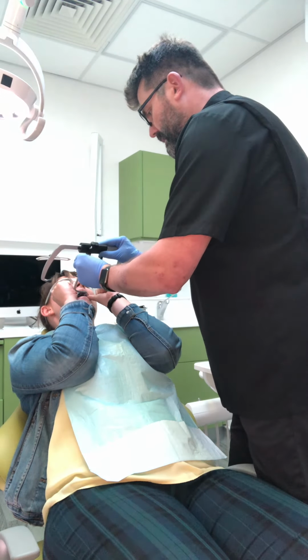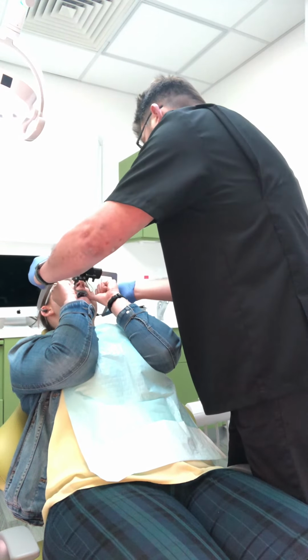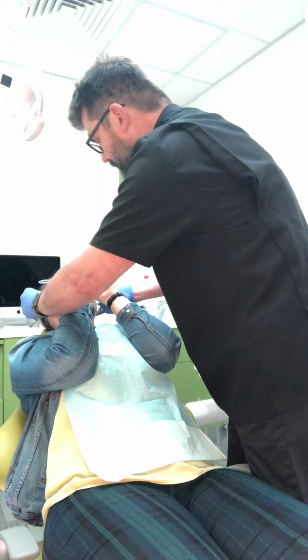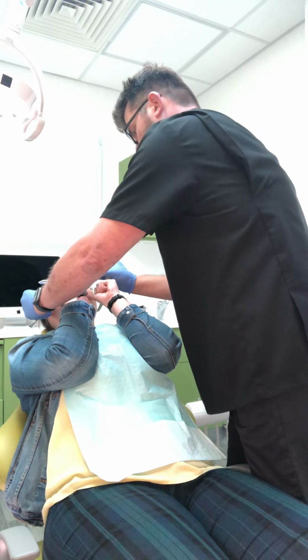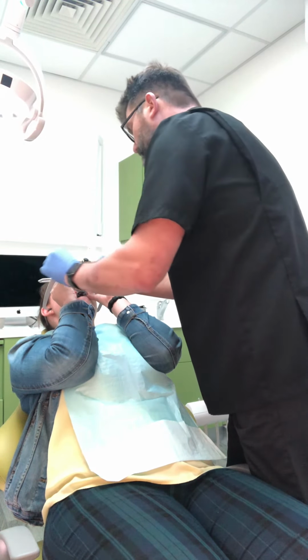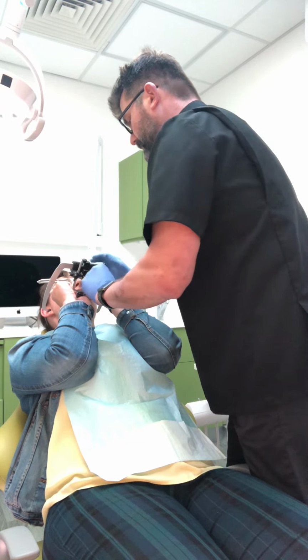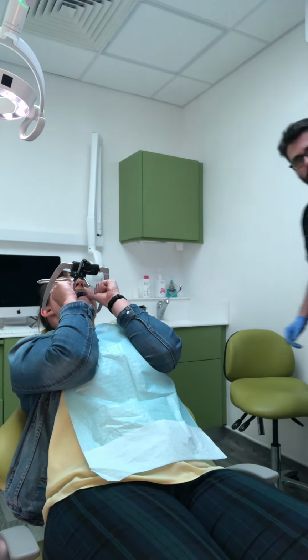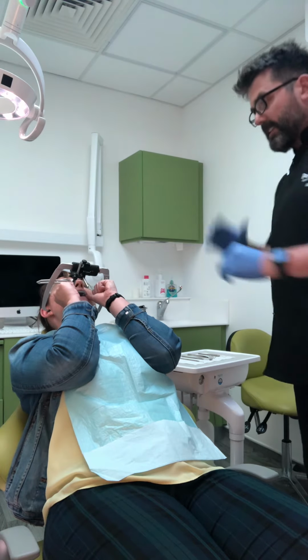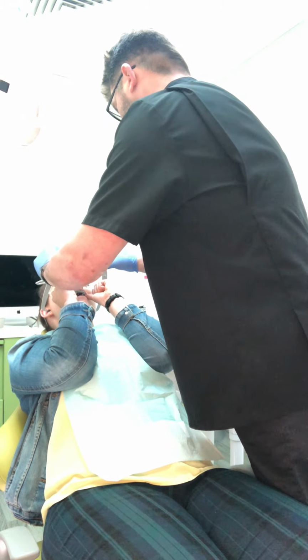So slide the universal joint down there until it engages in your patient's ears, and then just pull forward a bit so you're on the anterior part of the external auditory meatus. Lovely, the world will go quiet. And then where your reference point is by the side of the nose, on the ala of the nose, just tighten up that one. Now what I want to do next is make sure that the Facebow is level with the interpupillary line. That didn't hurt at all. And that's what that's there for.